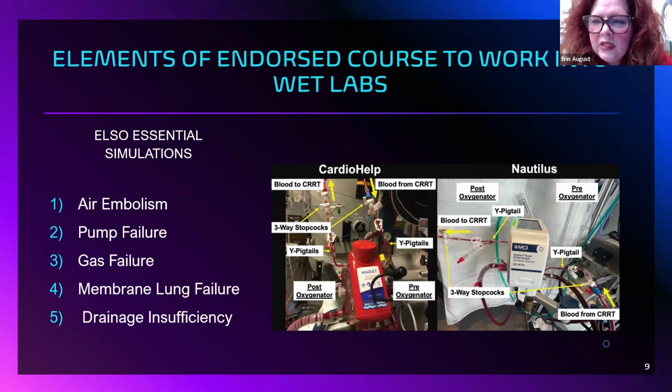Pump failure. Pump failure can be a multitude of things. Whether you're using the Cardiohelp that's all in one, that would be a primary console failure, versus if you're using Rotaflow or Medtronic 560 or Sorin or any CentriMag, any of those other consoles that we use out there that have a couple of different parts to them. In those cases where we can do things a la carte, you have a pump and then you have an oxygenator and then you have the console. On those pump failures, we could have an actual motor head failure versus is it a primary console failure? So it's all depending on your device.